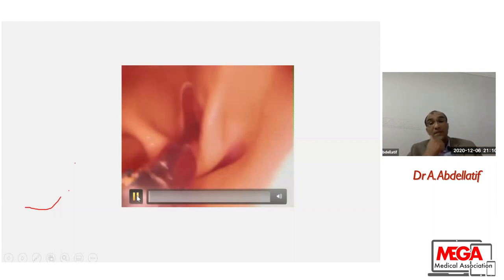I have recorded this video because I was not convinced about the 90 degree anti-clockwise. So I used a mannequin and I used two fibroscopes. One coming from the mouth with the tube loaded for intubation, and one from the nose and stayed just when it passes out of the nasopharynx to record what is happening when the tube is advanced. We used a big tube to make a gap problem intentionally. So we'll see this video.